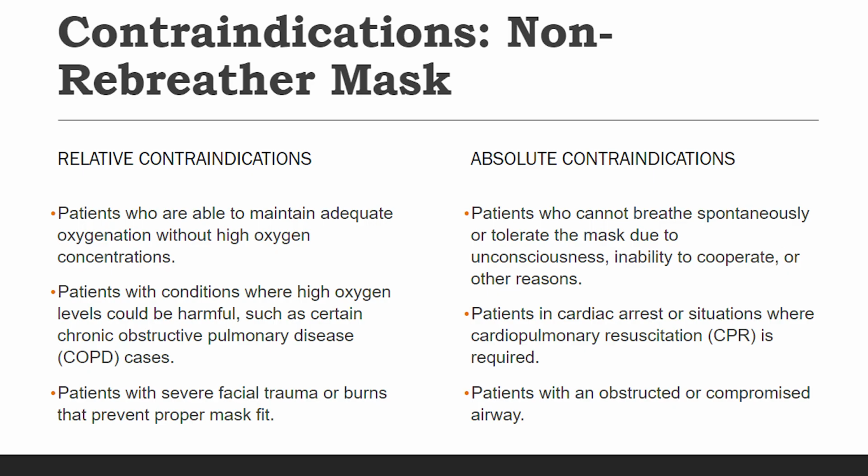Contraindications of the non-rebreather mask. As with any medical intervention, it's essential to be aware of situations where the non-rebreather mask should not be used. These contraindications can be classified into two categories, relative and absolute. For relative contraindications, patients who can maintain adequate oxygenation without high oxygen concentrations may not require the non-rebreather mask. It's crucial to assess whether the mask is truly necessary for such individuals.